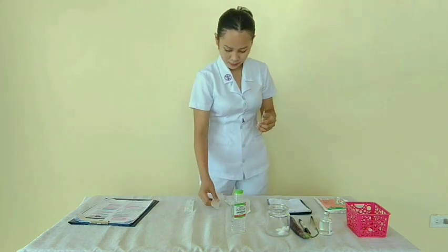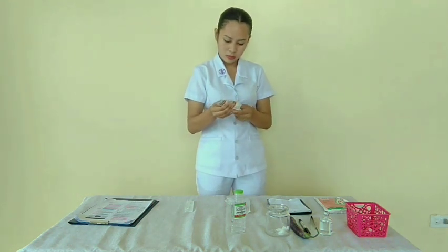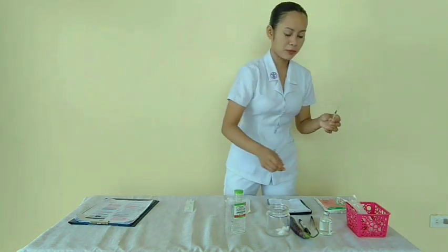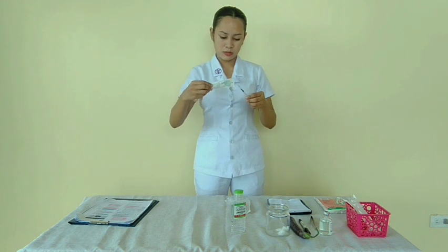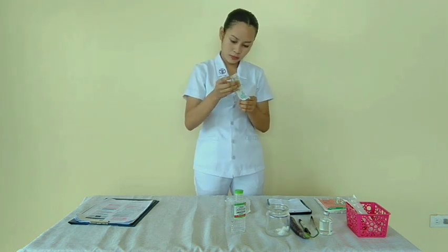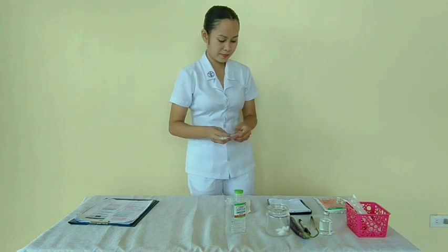And now remove the needle tip, discard this aspirating needle, and connect this barrel now to the appropriate size of needle. Then place it into a hypodermic tray.